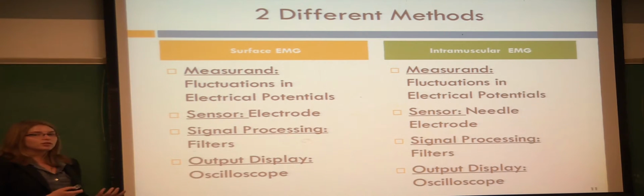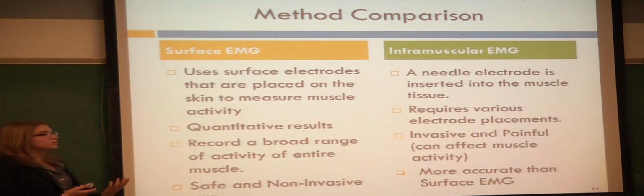The signal processing is the filters that Jenna mentioned previously. The output display is going to be the oscilloscope on the PC computer that the doctor has in the office. So, the difference between the two methods that are being used.